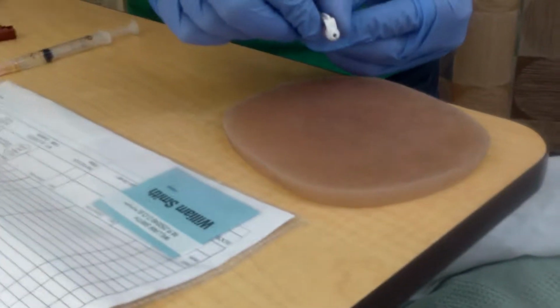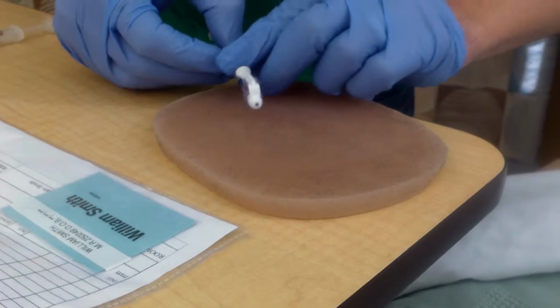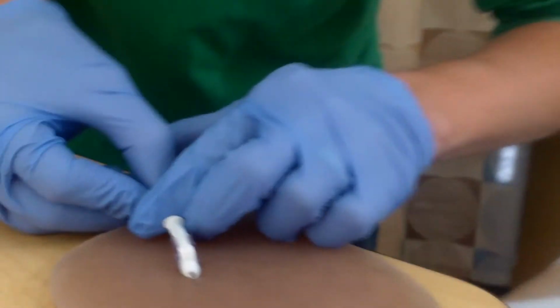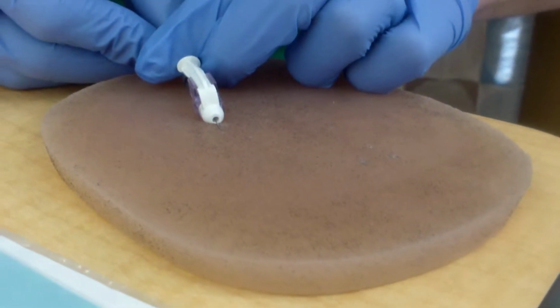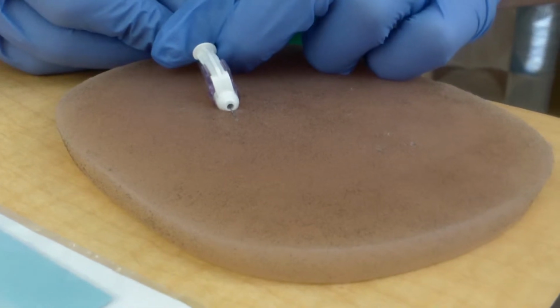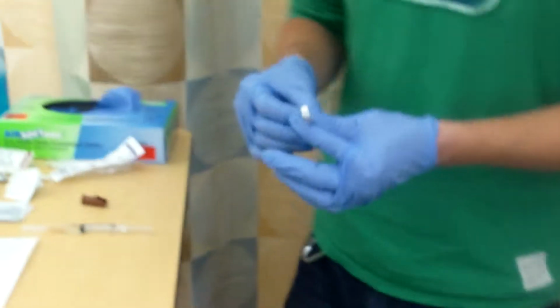Take that off. Now making sure the bevel is up, I will insert the needle very, very carefully, about 5 to 15 degrees. Insert it just so the needle goes underneath the skin, and then slowly apply and hopefully get a wheel, but this stuff doesn't do that. There we go. And then carefully withdraw the needle. Done. And then this goes in the sharps container immediately.